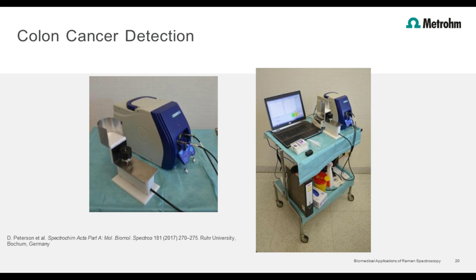So I also wanted just to make clear that this type of analysis is often done with other types of cancer, so not just breast cancer, but often the method of data collection and data treatment using multivariate analysis is very similar. And I also wanted to show an example of what a setup for an operating room might look like. So this is from a team at Ruhr University in Bochum, Germany.